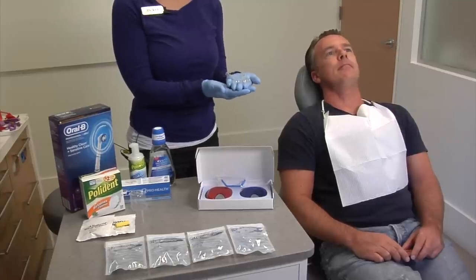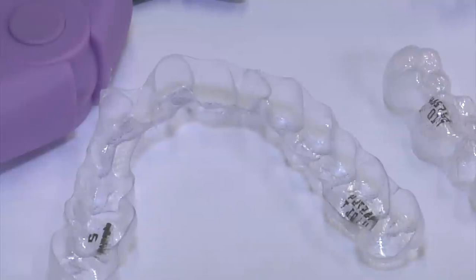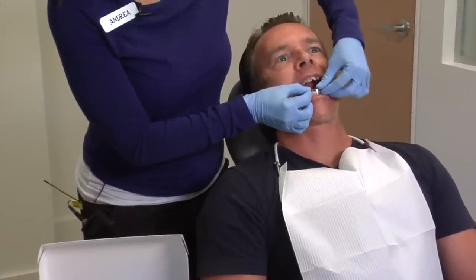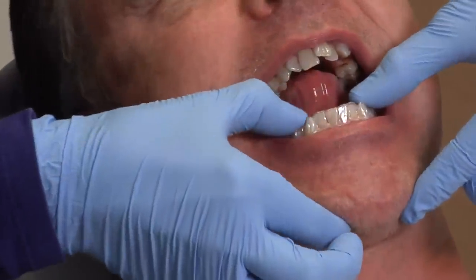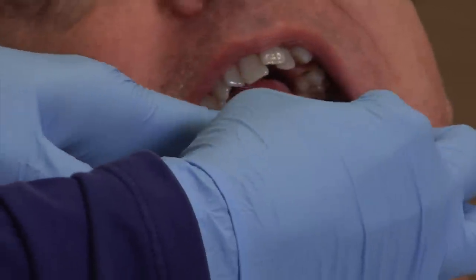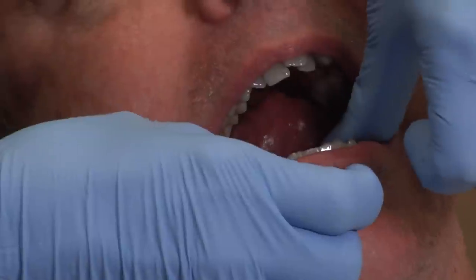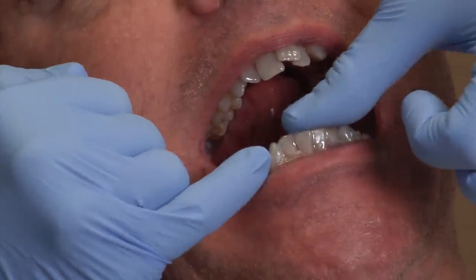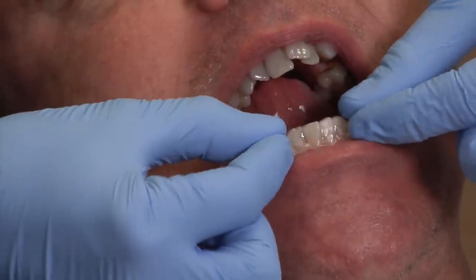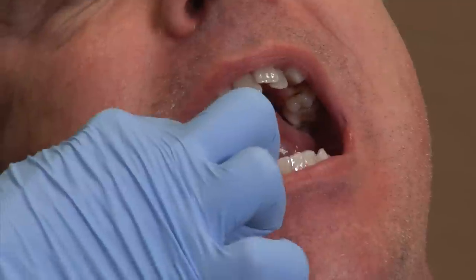We're going to insert the first aligners in the patient's mouth, starting with the lower aligner. Take the aligner and match it up — you can see exactly where they line up on the teeth — and just gently press down everywhere on the biting surface. You want to make sure the aligner is properly seated everywhere, with no void between the tooth and the aligner. If you see a space, it's improperly fitting, so press down everywhere to make sure it's fully in place.